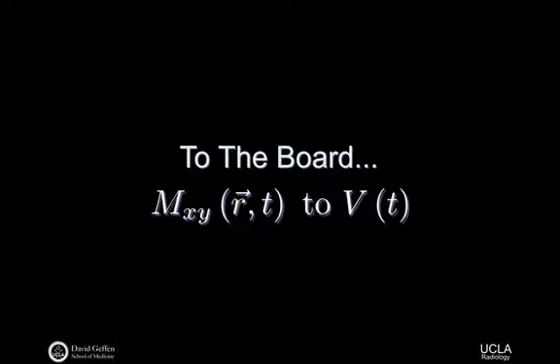Just remembering, I said it just a second ago, this B receiver field is not some function of time, right? That just means that this hardware element that we call the coil is just stable, right? That may not be exactly true, but in general, it's just a hardware component that's sitting there. Okay. So let's write down this B receiver field, and we'll write it out in component notation because that'll be useful for us in a second here. So our B receiver field is a function of space, with an expression that looks like B_R on the X component along the i-hat direction, plus B_R Y component along the j-hat direction, plus B_R on the Z direction.